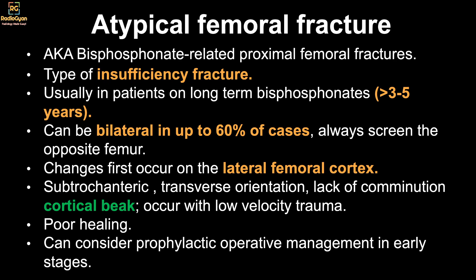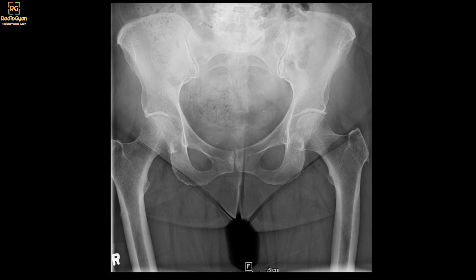Atypical femoral fractures begin with subtle cortical breaks along the lateral cortex of the femur. They are usually subtrochanteric — anything less than five centimeters from the lesser trochanter is known as subtrochanteric. Subtrochanteric transverse non-comminuted fractures are common in patients with long-term bisphosphonate therapy.